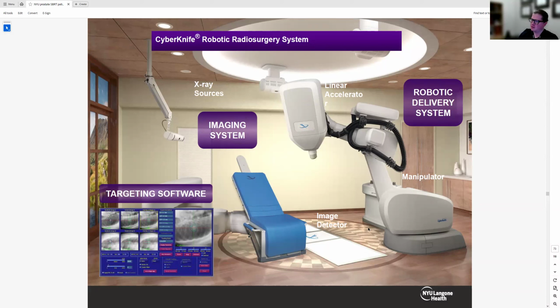Well, oftentimes, depending on the cancer site, for example, an early stage lung cancer being treated with radiation, we can put little gold markers into the tumor. Now, these are different from the markers I talked to you about before, which were brachytherapy seeds, which were radioactive. These markers are just little gold seeds that are very small. They can be placed by an interventional pulmonologist, oftentimes the same way that these tumors are biopsied. So maybe 1, 2, 3, or 4 markers will go in right around where the tumor is or inside the tumor itself. Then the X-ray will see where those markers are because they're really bright on an X-ray, and monitor where they are in real time.